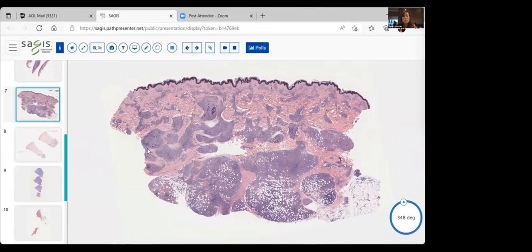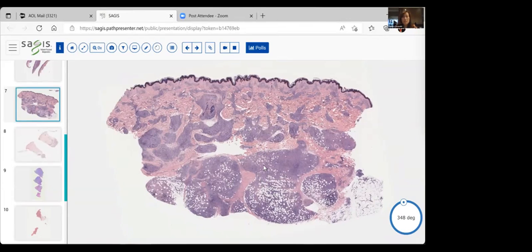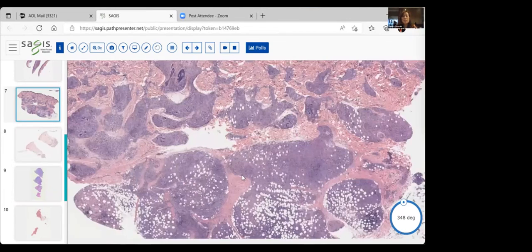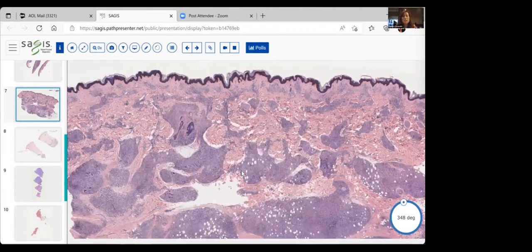And you can also see in this condition some of these linear granulomata. Do you see that? They're linear. They're almost like, again, we call them sausages. And it makes you already think of an entity, right? It already makes you think of Hansen's disease when you see linear granulomata. So we want to look close and see, is this going to be one that has multibacillary, or lots of bacteria in it, or is it going to be paucibacillary?